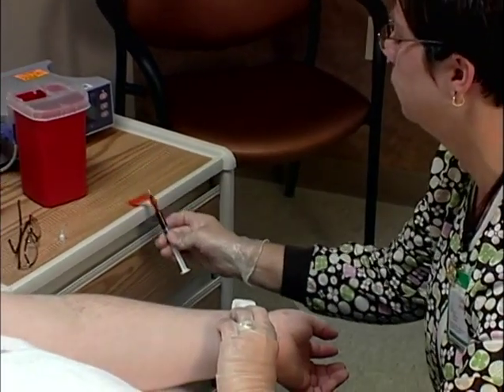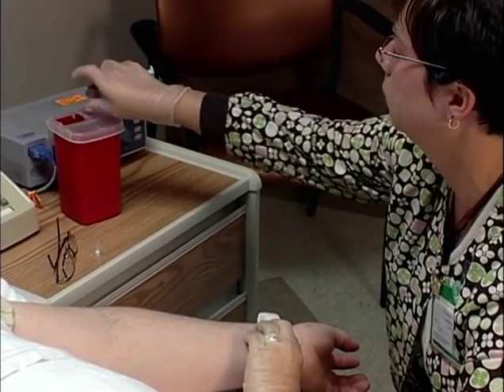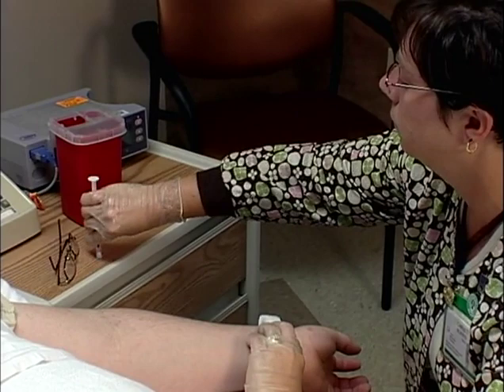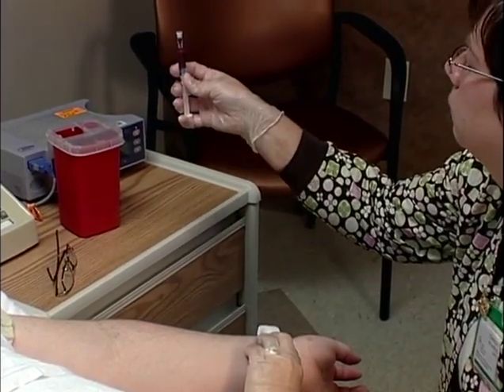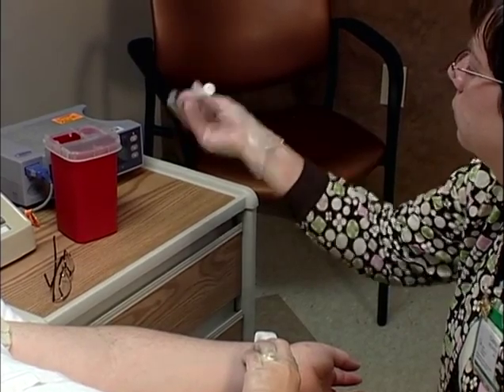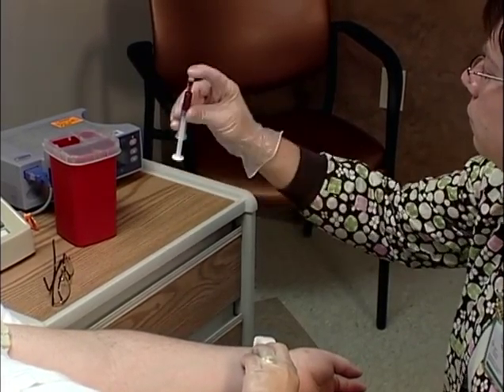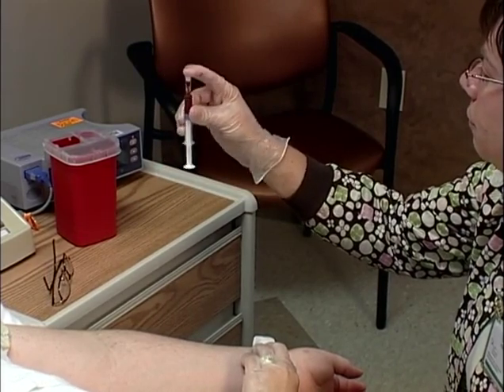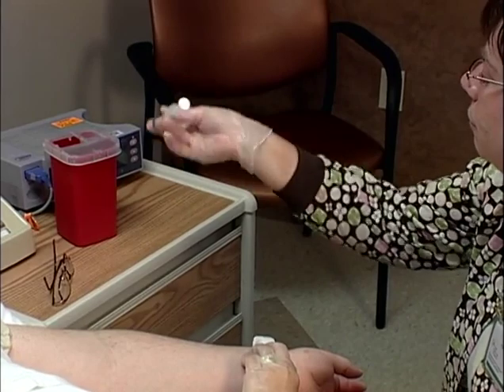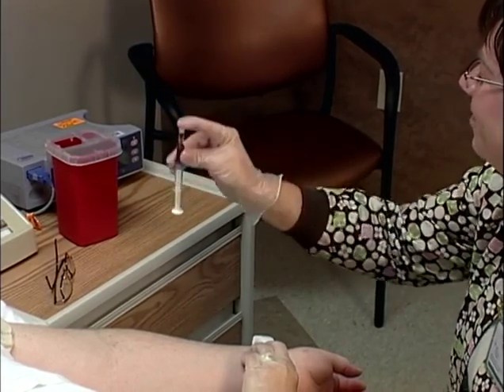Place a dry gauze pad over the puncture site, quickly withdraw the needle, and apply pressure. Immediately activate the needle's safety mechanism. Remove and discard the needle into a sharps container. Expel any air bubbles from the syringe according to the manufacturer's instructions. Cap the syringe and gently invert it to ensure thorough mixing of the blood and anticoagulant.